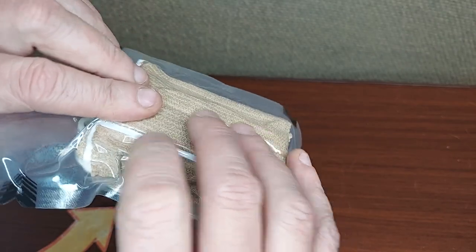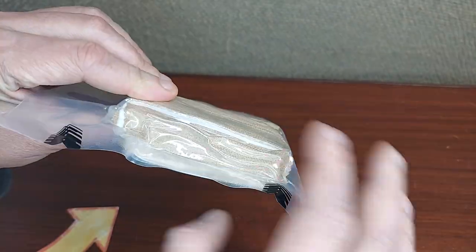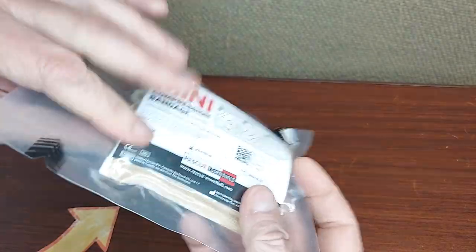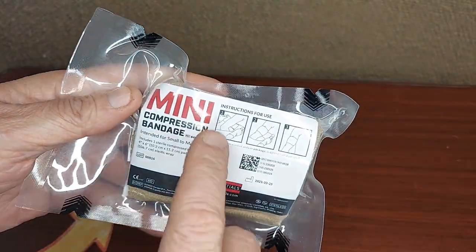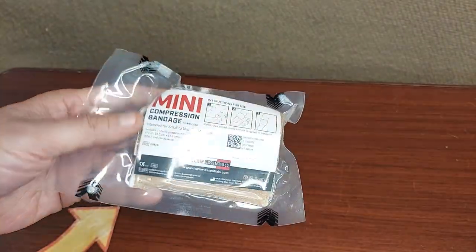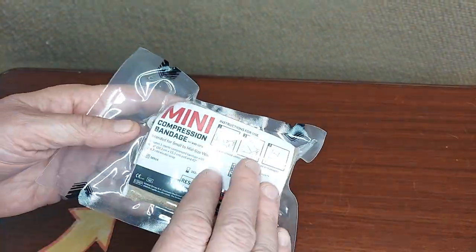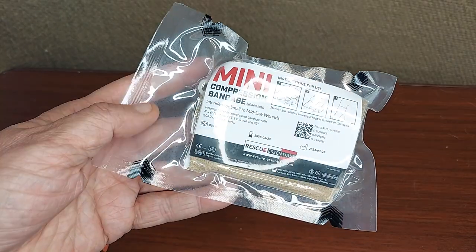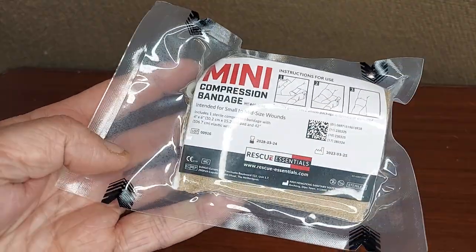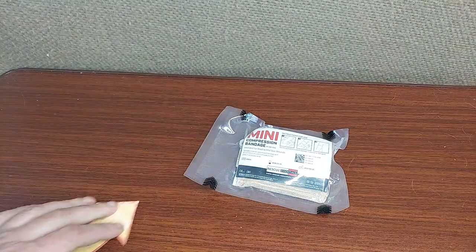It's all clear so you can have a really good idea visually of how the product is doing. You can feel and see the vacuum, and there are quick instructions on how to use it for anyone who might not be familiar or who might just need a refresher in a stressful situation. The mini compression bandage from Rescue Essentials — great piece of kit.